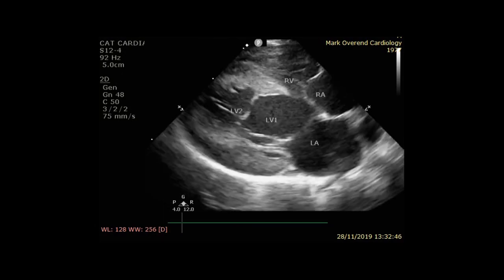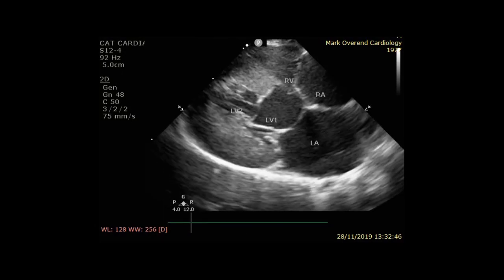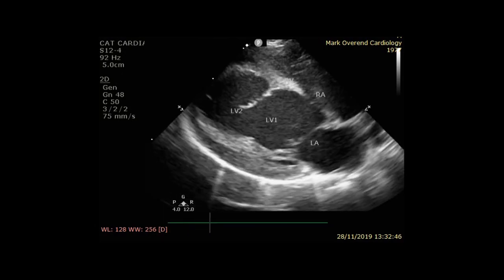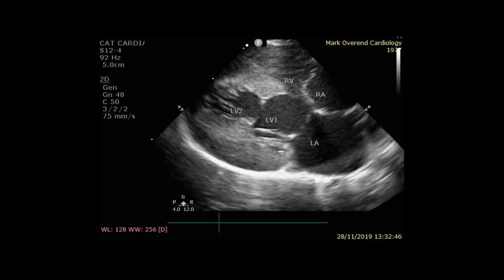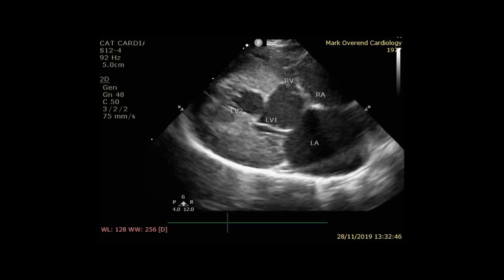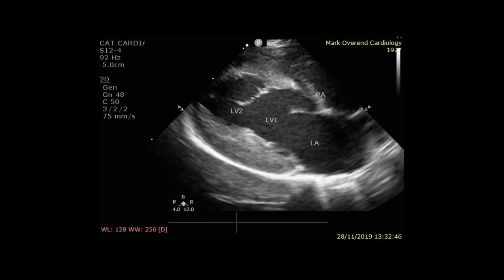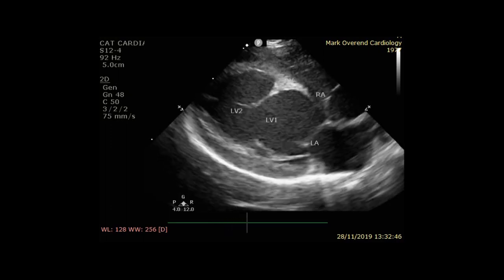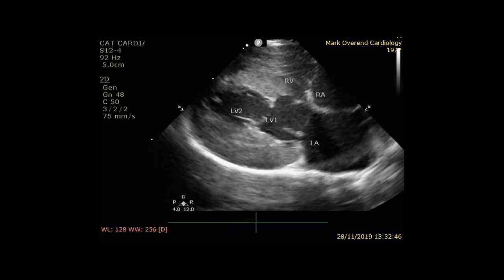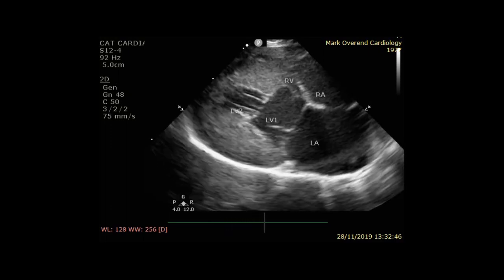Here's the same view in slow motion. As you can see, the motion of this false tendon gives the impression that there are two valves within the left ventricle.